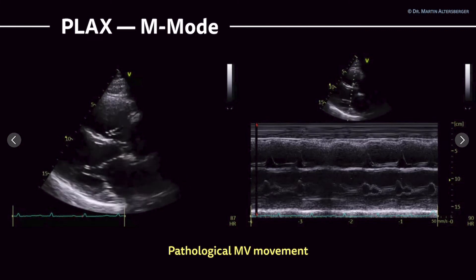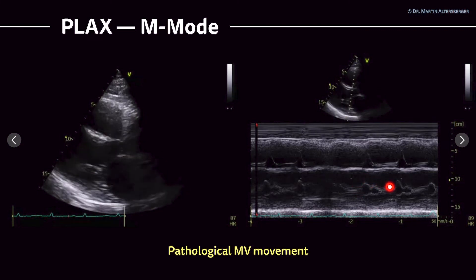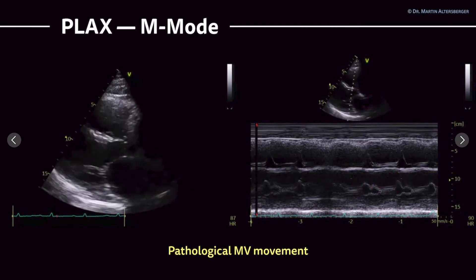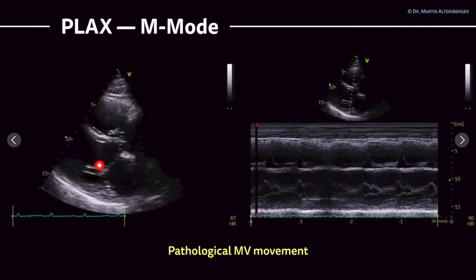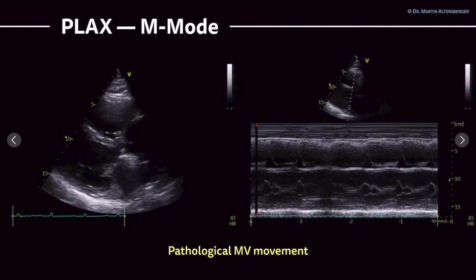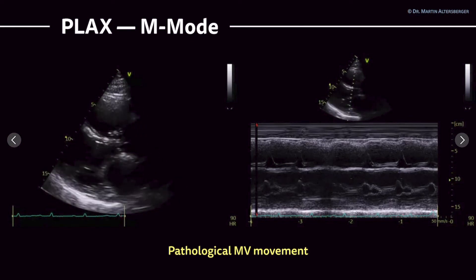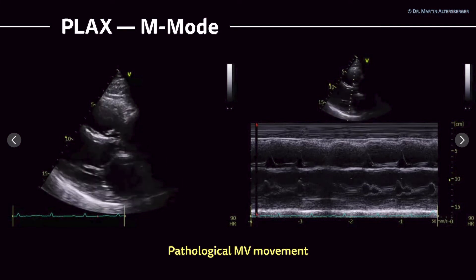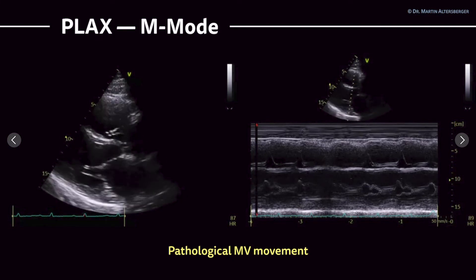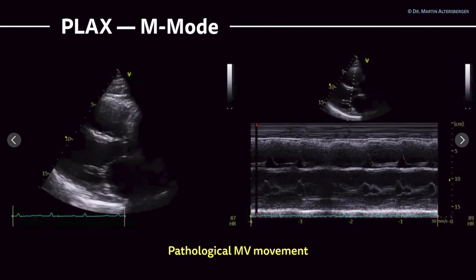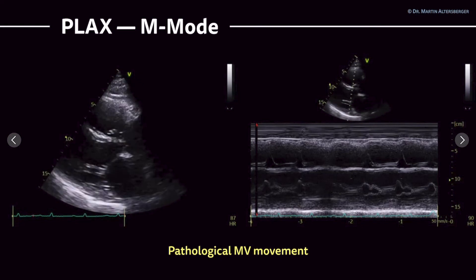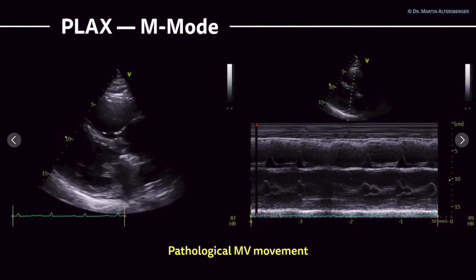We can focus here on the mitral valve, and this is definitely a pathological movement. We can display this already in the B-mode image where we see a reduction in the opening of the mitral valve, but not due to stenosis — it's not mitral stenosis we are seeing, but it's probably severely reduced left ventricular function. And we have this premature closure of the valve, which we do see here and in the M-mode measurement.